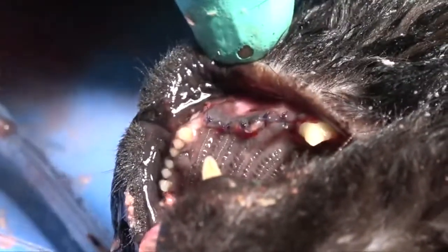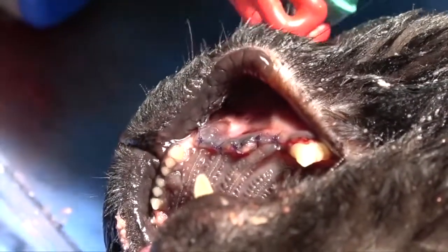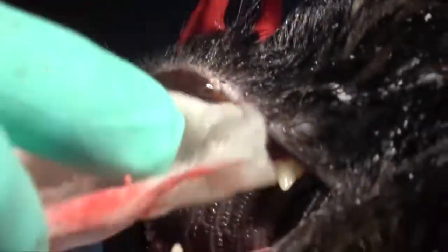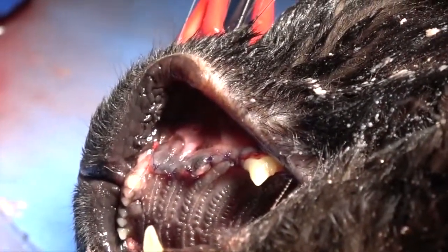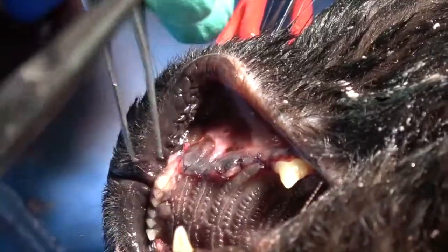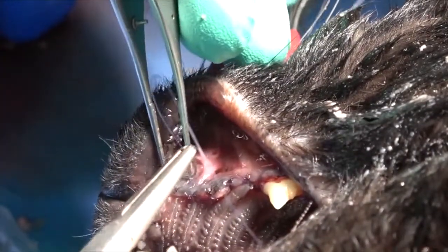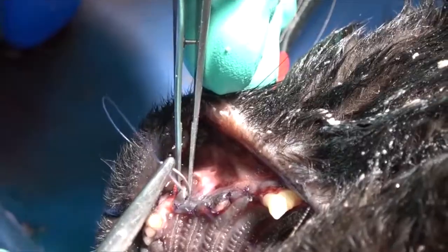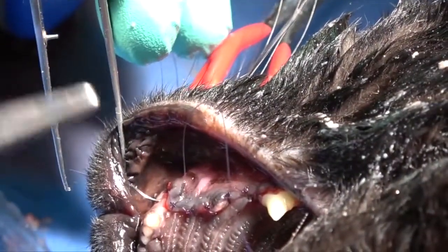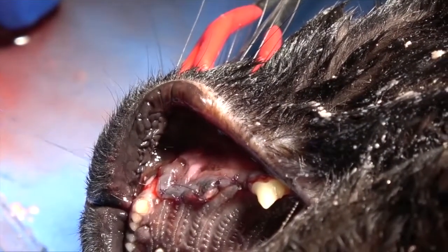We've got the envelope portion of the flap closed. Now we're going to close the releasing portion. It's a little bit more difficult to visualize just because that lip is there and trying to retract the tissue makes it harder to see on video. One thing you can do is use a little clamp on the lip to hold that tissue back while you suture. The other alternative is to have an assistant help you in this phase to speed and facilitate closure as quickly as possible.